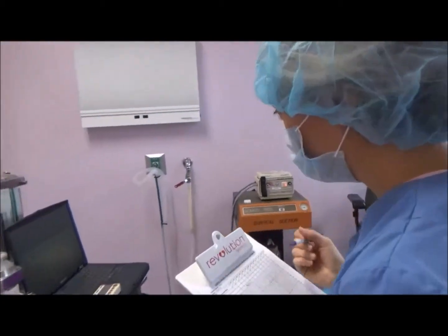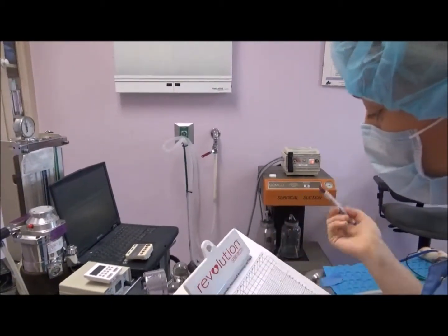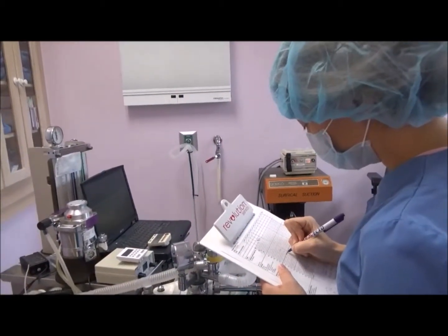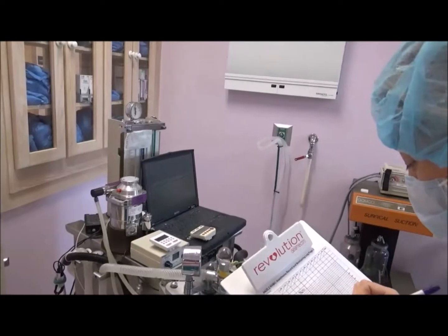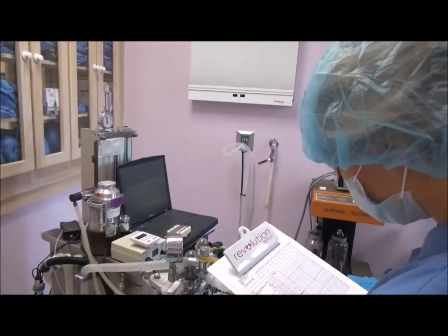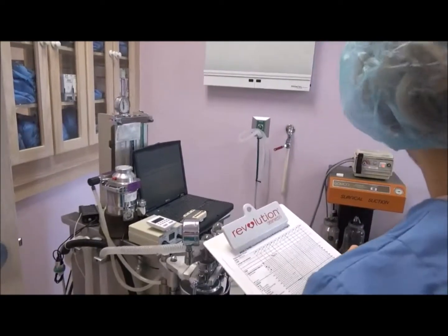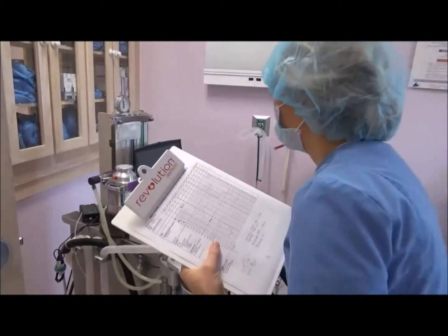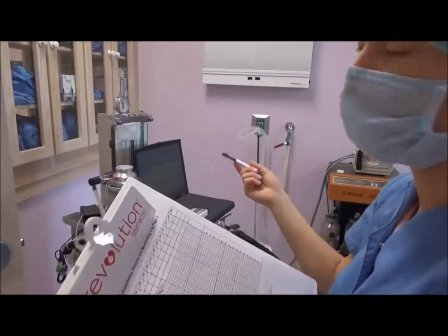Okay, so in here, temperature, it's about 97.5. I'll just make a mental note of that. It's not really noted on the chart. Pulse ox, he's at 99%. Chart that. Heart rate's at about 92. Respiration's 32. Blood pressure, I'm just going to manually inflate that, and I'll check that once it's done.